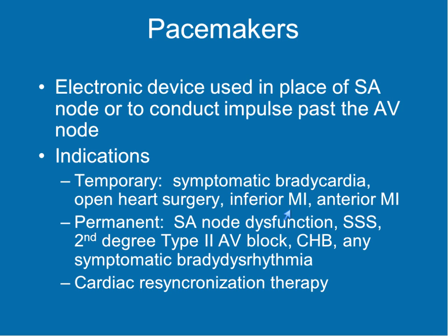Save that in your little old noggins for when we talk about heart failure. I'm sure I'll be repeating it, but it probably doesn't hurt to hear this stuff more than once. So back to pacemakers: temporary, permanent, and what they do ordinarily.